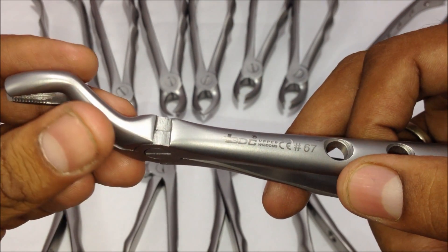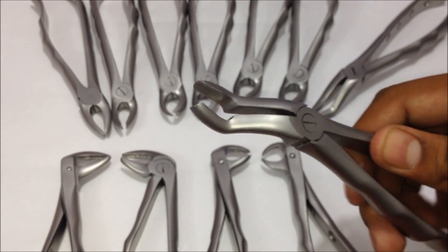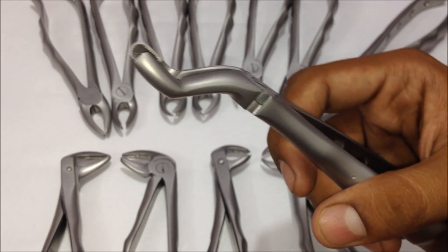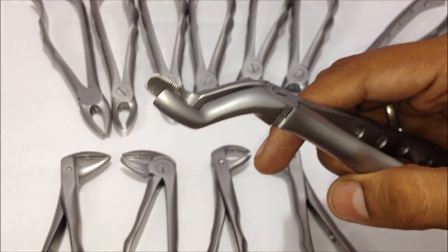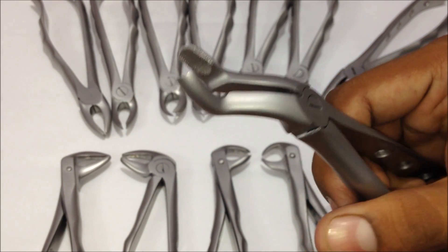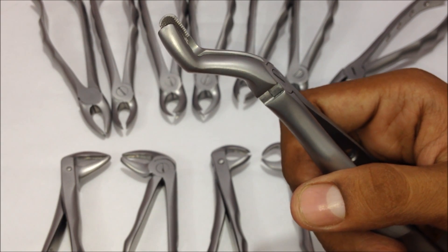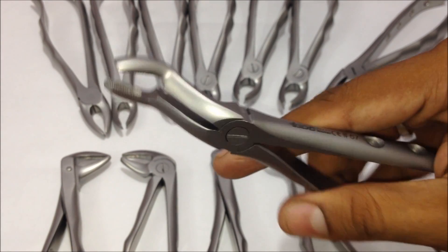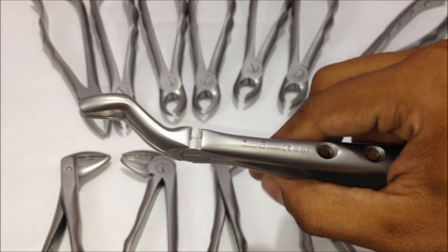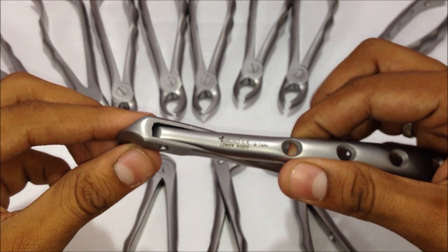The last upper forceps is the upper wisdom forceps, number 67, used for the third molar extraction of upper third molars. This is how it's held, and it has two wide grooved areas. It is a single forceps that can be used for both left and right upper third molars.